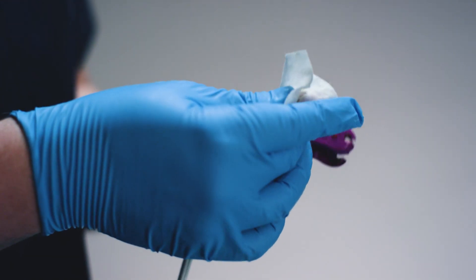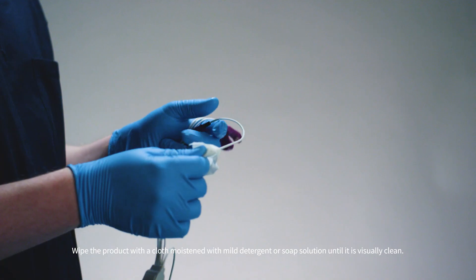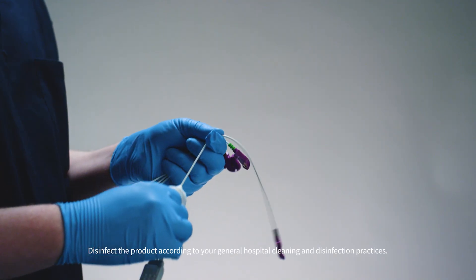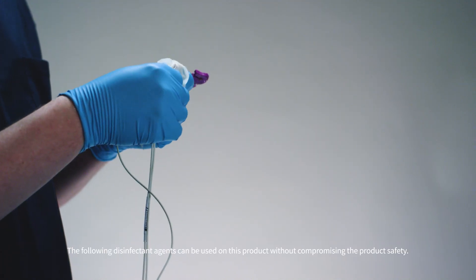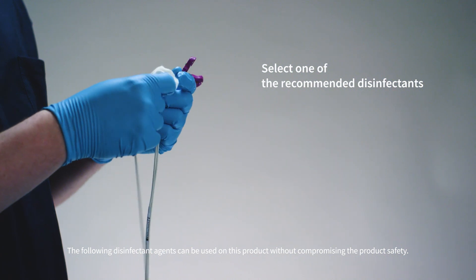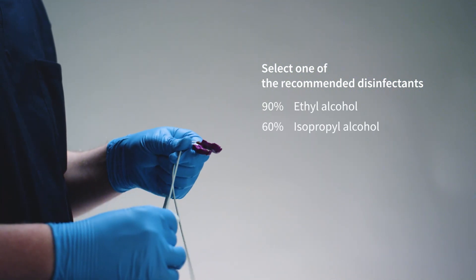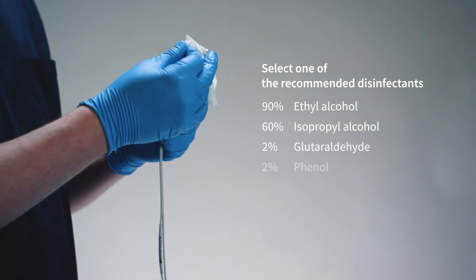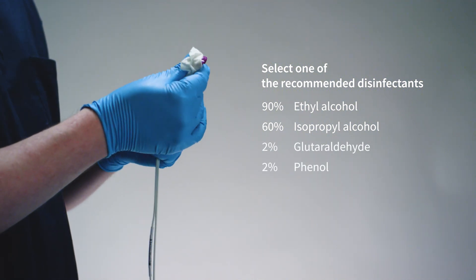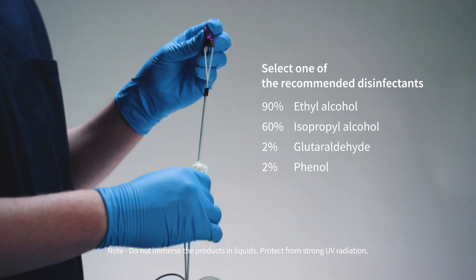The electrode sensor can be cleaned and disinfected as follows. Wipe the product with a cloth moistened with mild detergent or soap solution until it is visually clean. Disinfect the product according to your general hospital cleaning and disinfection practices. The following disinfectant agents can be used on this product without compromising product safety: 90% ethyl alcohol, 60% isopropyl alcohol, 2% glutaraldehyde, and 2% phenol. Do not immerse the product in liquids and protect from strong UV radiation.